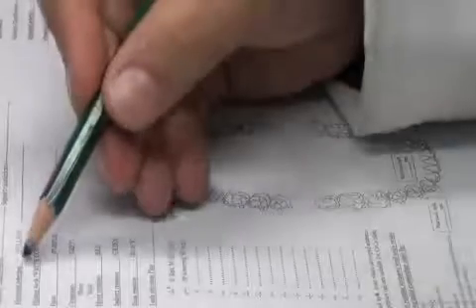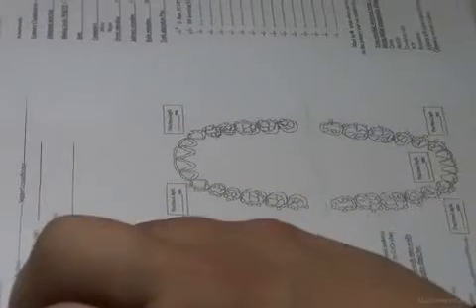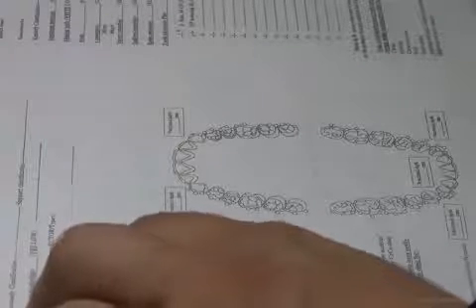So whatever we're talking about in terms of abutment teeth, they are not by default the ones close to the saddle. When we select our primary abutments, we have to make sure that these abutments are suitable for their purpose. And abutments mainly are called abutments when they take support. They take rests on them, okay? And definitely the other components of retention. So even if the tooth is close, it doesn't mean it's a primary abutment, so we have to check the quality of the tooth before deciding.